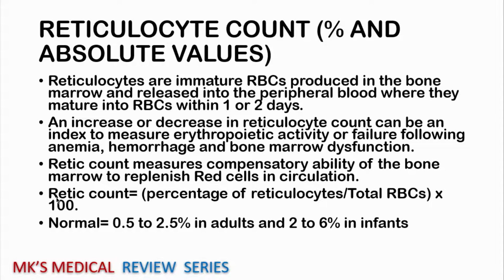And an increase or decrease in this reticulocyte count can be an index to point us towards the erythropoietic function or failure following anemia or hemorrhage or bone marrow dysfunction. So remember that the reticulocyte count is measuring the compensatory ability of the bone marrow to replenish the red cells in circulation.